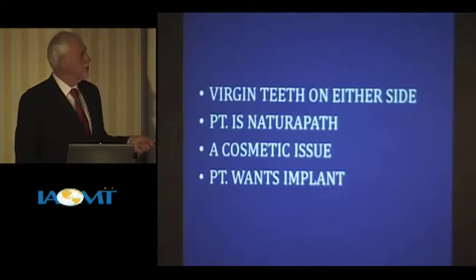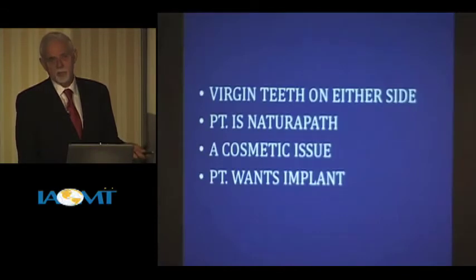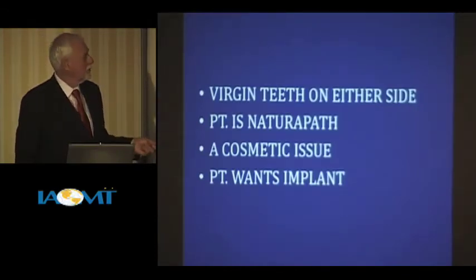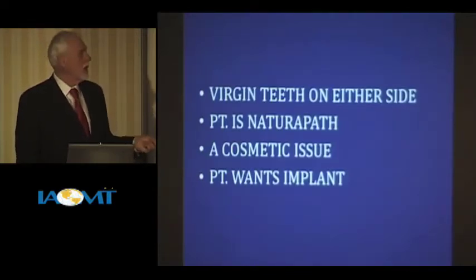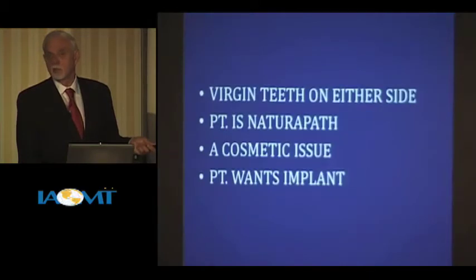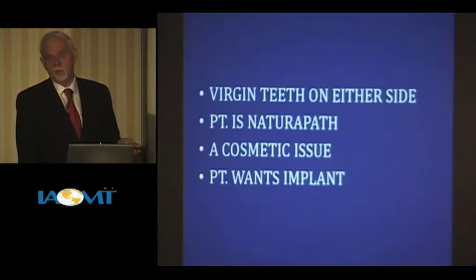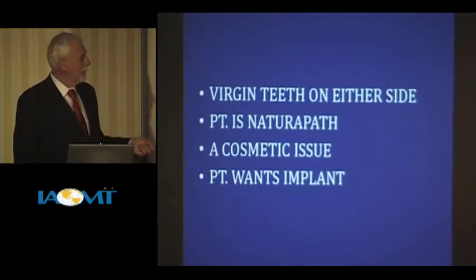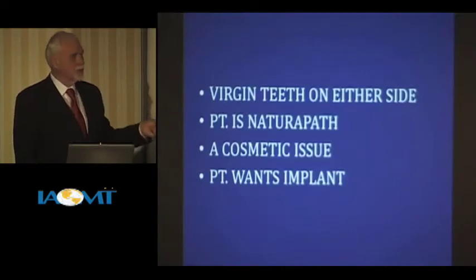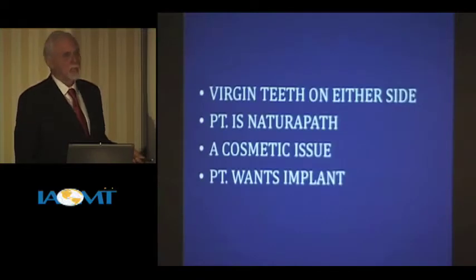So what? You'd pick this up on a traditional digital x-ray. However, virgin teeth on either side, patient is a naturopath, very aware of energy, great energy person. It was a cosmetic, an attractive woman. She wanted a replacement. She did not want a bridge. She did not want those other two teeth prepped. She was okay with an implant. Now, we'll talk about that later. I know there must be different opinions in this audience about implants, so I'll tell you what my experience has been. But at any rate, she wanted an implant. She had the knowledge and the training to be able to give me an intelligent answer.